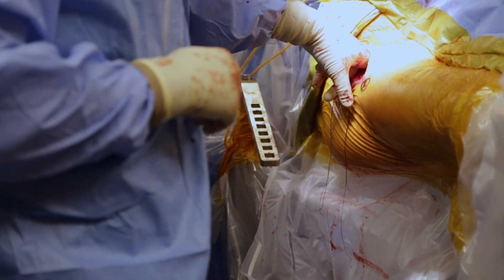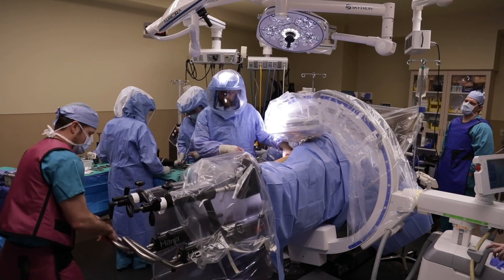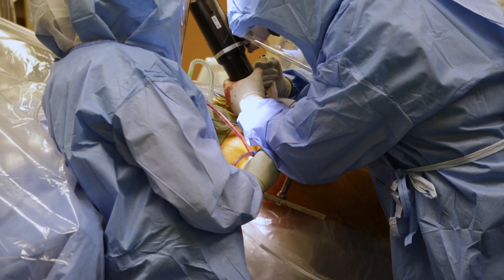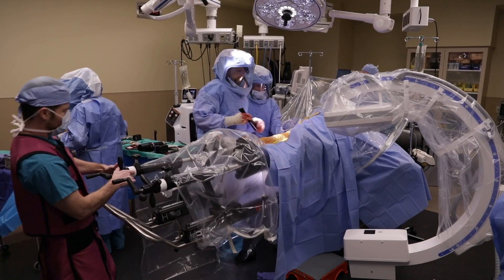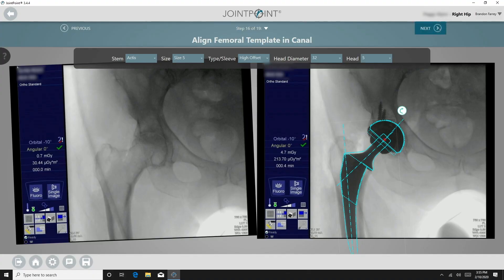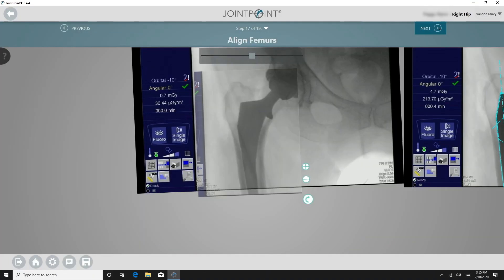I check the leg for instability by externally rotating the leg to 70 degrees and bringing the leg down to the floor. If the hip is stable, it will not come out anteriorly. The final implant is then impacted and the final reduction is performed. At this point the surgeon can choose to use the One Trial Analysis again to assess leg length and offset, though I find it no longer necessary given the accuracy of the software.